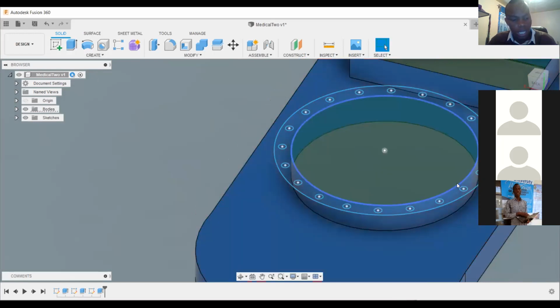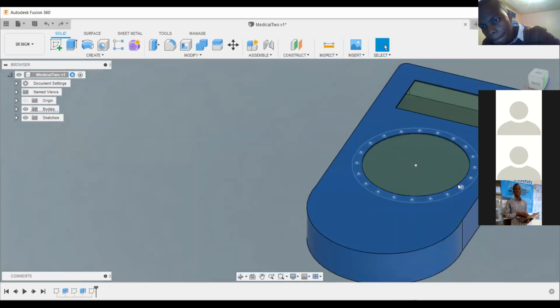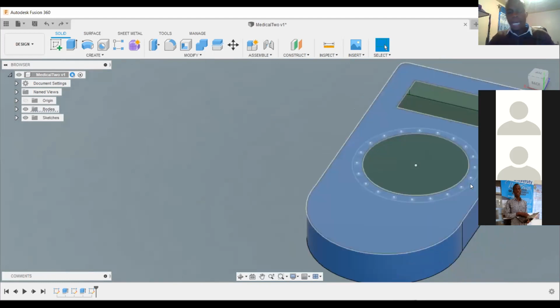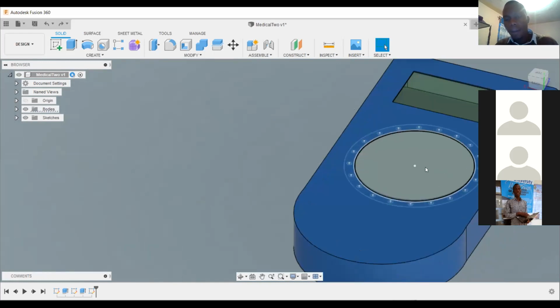Mr. Bob, yes. How do you draw a triangular pattern for those circles also? How do you draw a triangular pattern? Those circles, there are many like that. Circular pattern. This is circular. Yes. So I'll show you again.